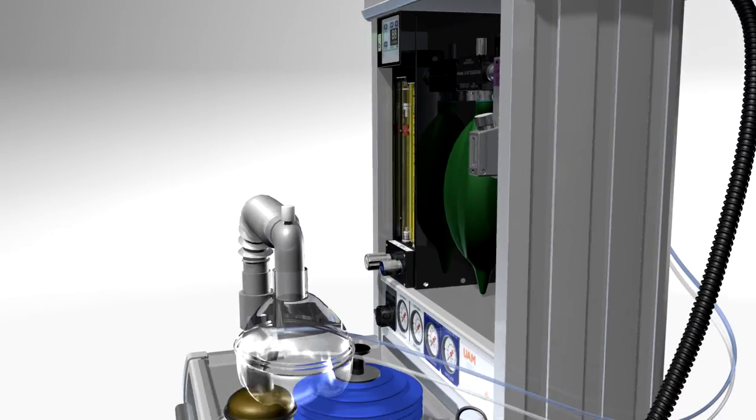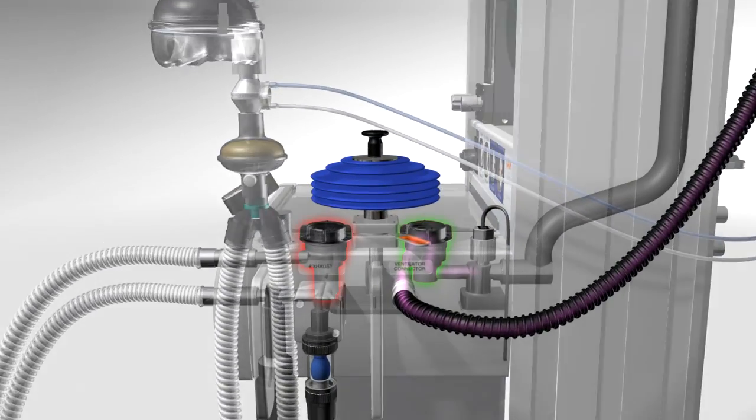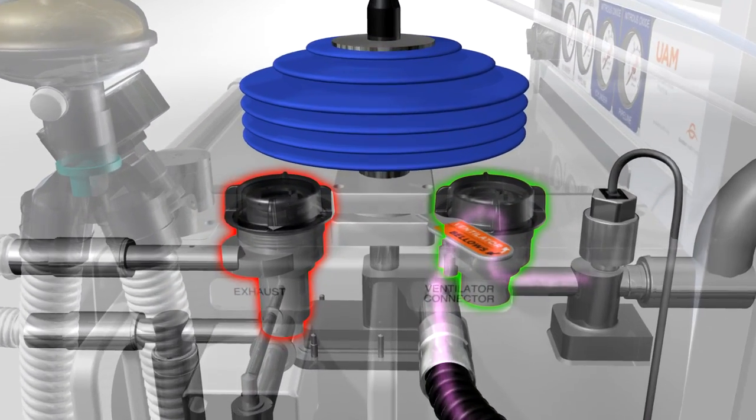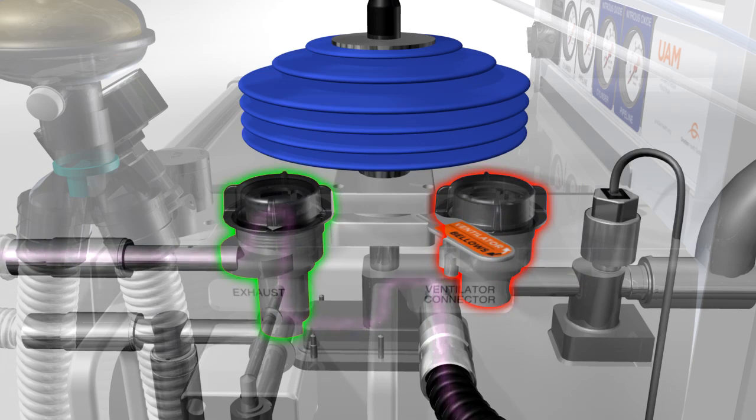Anesthetic gas is delivered to the breathing block and through the one-way valves and inspiratory limb in the same way as the manual bellows shown earlier.